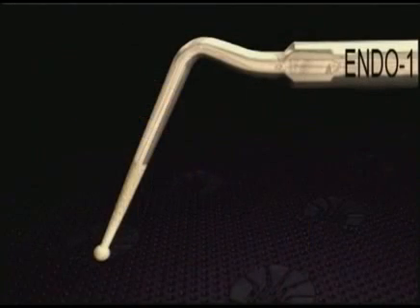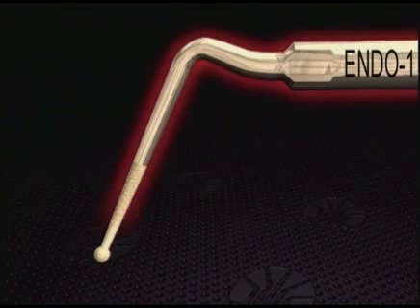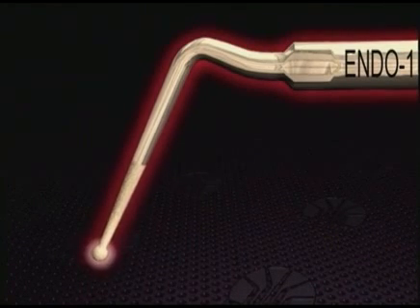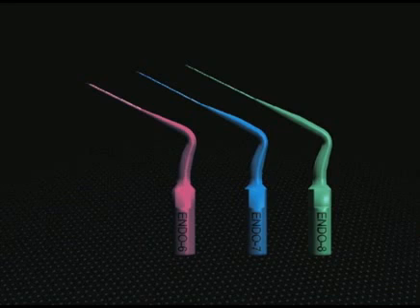Because of its superb energy transfer, the Endo 1 will frequently dislodge most posts. This ultrasonic instrument has a ball at its working end, which, when kept in intimate contact with a post, maximizes energy transfer and promotes cement bond failure. The ProUltra Endo 6, 7, and 8 ultrasonic instruments are made of titanium to provide clinicians with thinner diameters and longer lengths as compared to the Endo 3, 4, and 5 instruments.